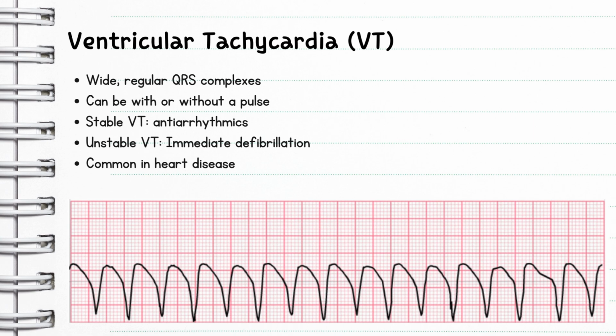So there's still a little electrical activity going through here, but the heart is not able to pump, and so we're not getting blood anywhere. And so it's only a matter of seconds, maybe minutes, before the heart stops. So we need to shock it to get it back into a normal rhythm before it stops. Okay. V-tach is commonly seen in patients with underlying heart disease. So keep an eye out for this rhythm in your cardiac patients.